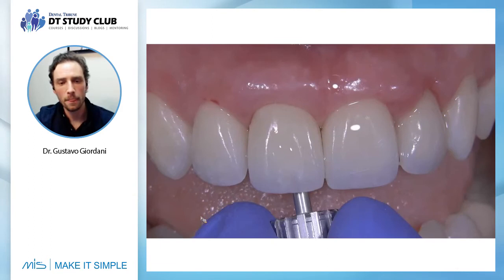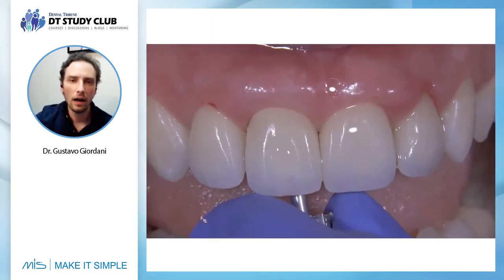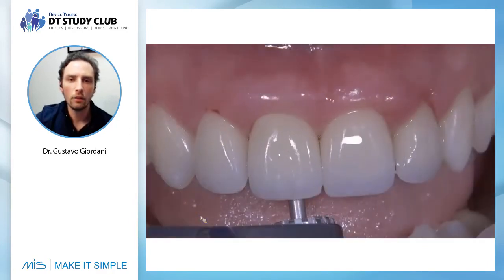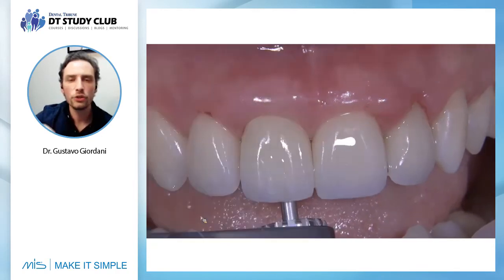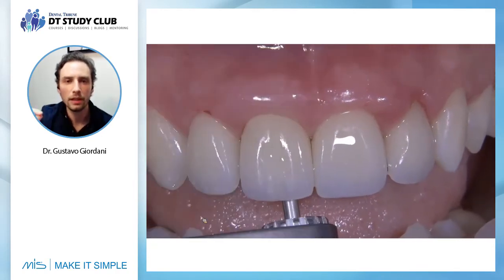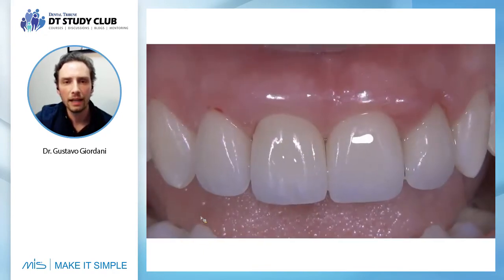final restoration. Now it's time to remove the rubber dam and to have our final implant restoration torqued inside the mouth. When you use the easy abutment, the abutment that we use from MIS, you cannot torque more than 20 newtons.